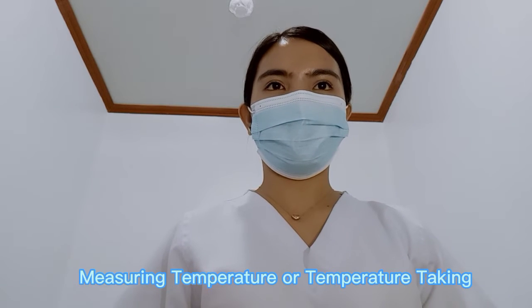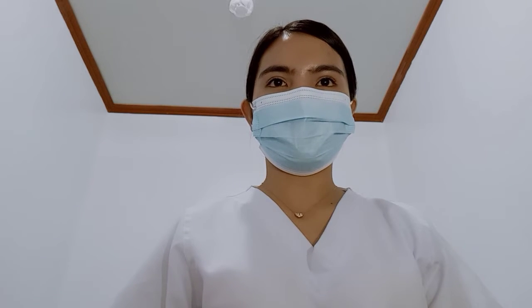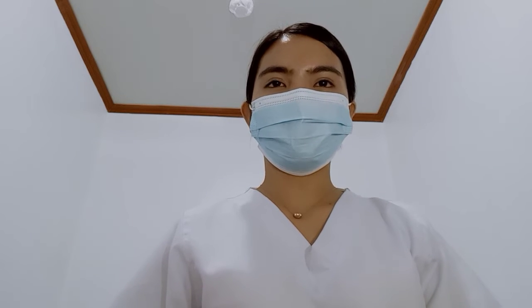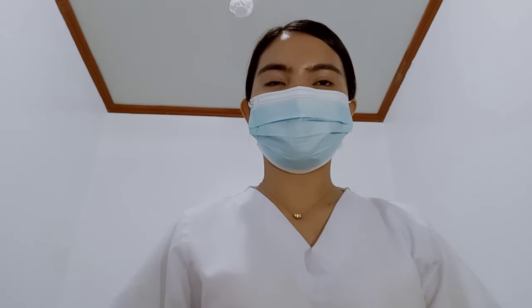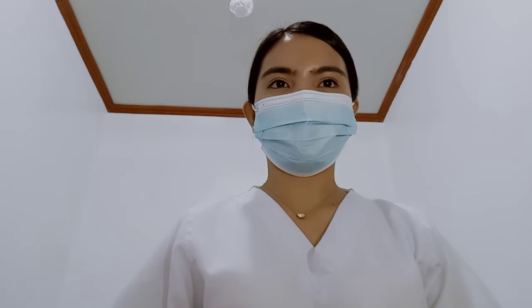Measuring temperature, or temperature taking. The definition of this is a process of measuring or monitoring the patient's body temperature using a clinical thermometer. It may be taken through the axilla, orally, or through the tympanic membrane. The normal auxiliary temperature range is 35.4 to 37.0 degrees Celsius. The normal oral temperature is 35.9 to 37.5 degrees Celsius. And lastly, the normal tympanic temperature range is 36.7 to 38.3 degrees Celsius.